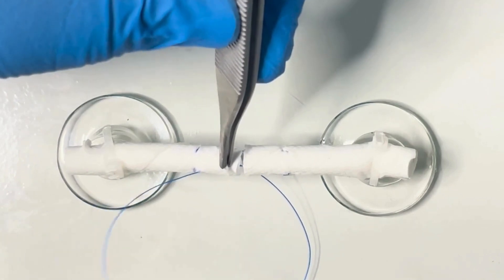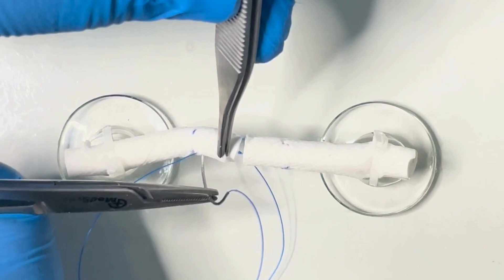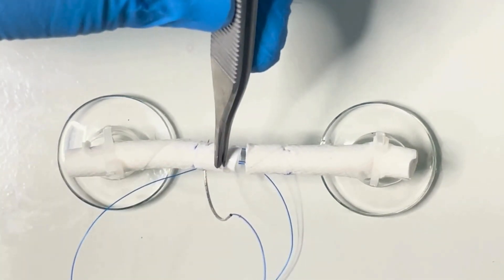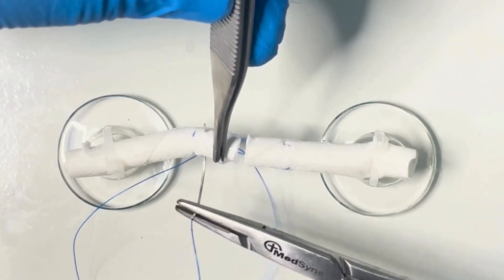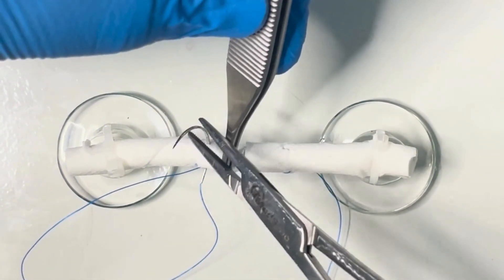A one centimeter straight bite. A bite across the width of the tendon. A straight bite ending in the middle of the two cut ends. Then do the same on the opposite side.